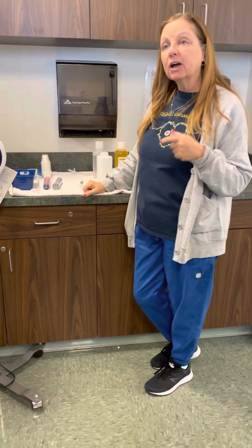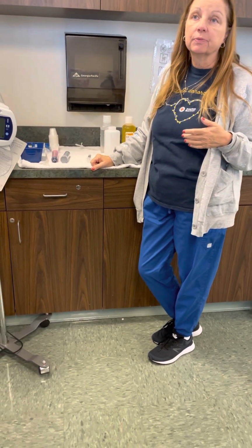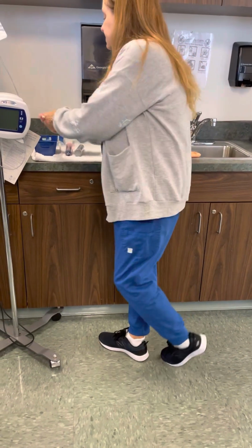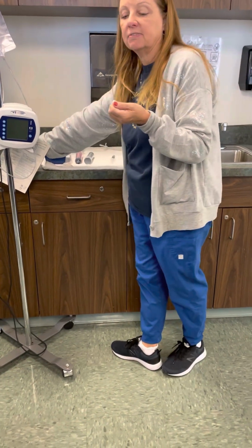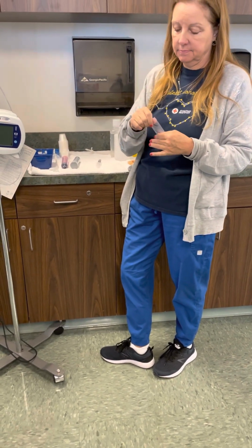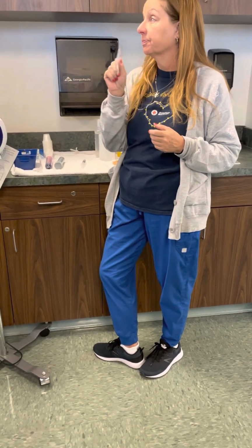Now, before we go back to the patient's room, of course you're going to look over what meds are due, and you're going to crush any meds that need to be crushed. Okay? So let's say, for instance, I'm giving my patient this medication. I'm giving them half a tablet of lisinopril. So first, before I crush it, what do I need to make sure? The right dosage.